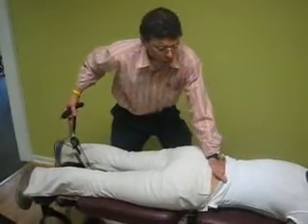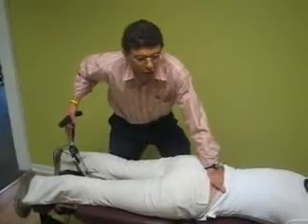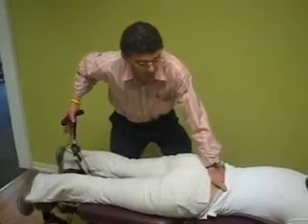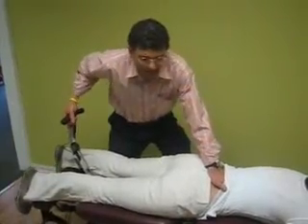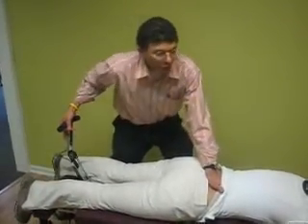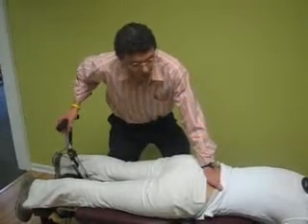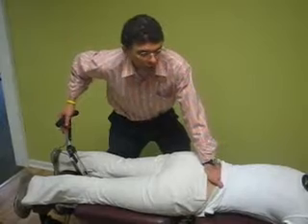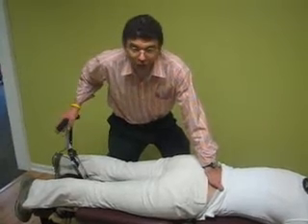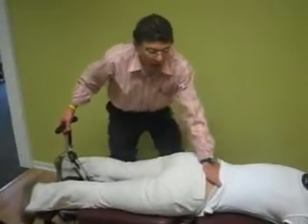What we're trying to accomplish is decrease the amount of compression on the disc. The disc is that soft tissue disc that is between the joints of your vertebrae in your spine, between the vertebrae, and there are a lot of nerve receptors on them. Decreasing the amount of compression on them will decrease the amount of pain a patient is having or other symptoms. What we're doing here — attached to all these bones in your spine are all the muscles — so we are very specifically stretching the muscles ever so slightly so they relax the areas around those areas of pain or problems.